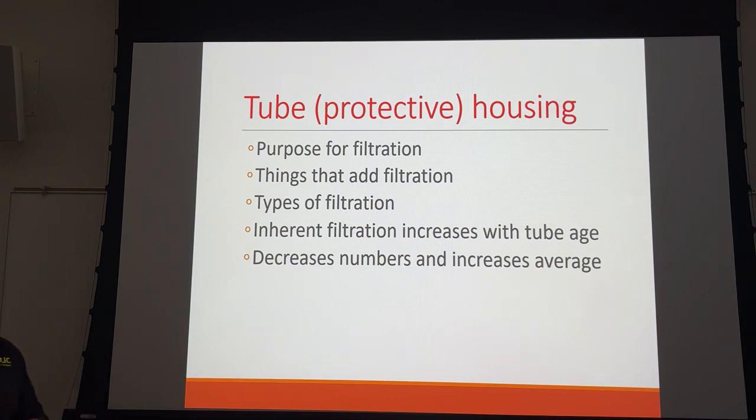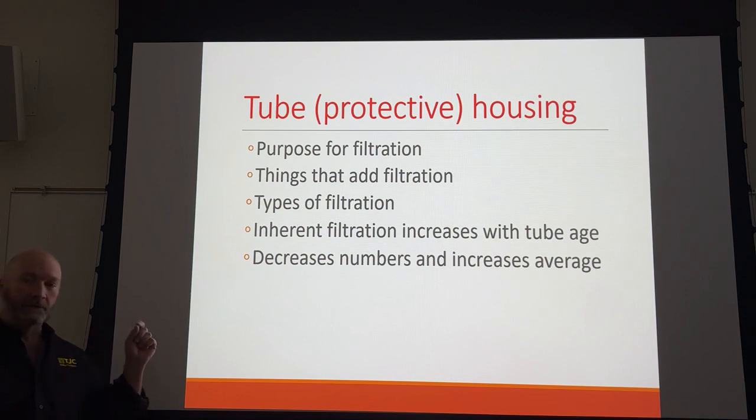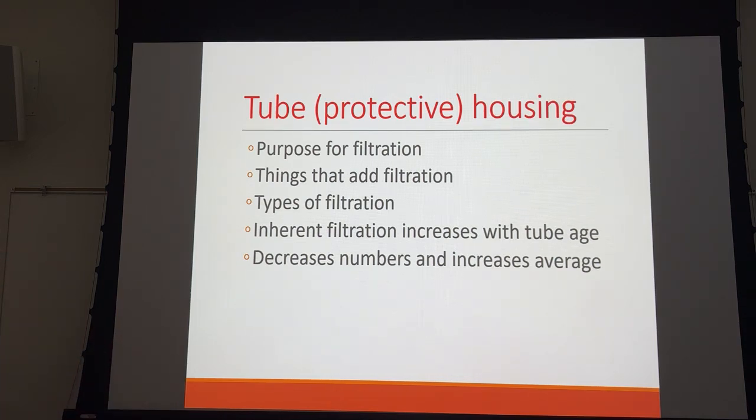And we said last semester, and it's going to hold true for this semester too, that inherent filtration, we're going to call anything that you have to legally make an x-ray, which means that in order to make an x-ray on the x-ray tubes that you use, which I'll shoot at 70 kVp or higher, then you're going to have how much filtration? 2.5 millimeters of aluminum, right? Equivalent, right? So each one of those things goes into that 2.5, as does, after it comes out of the housing, you got the collimator housing, and the mirror provides some as well.